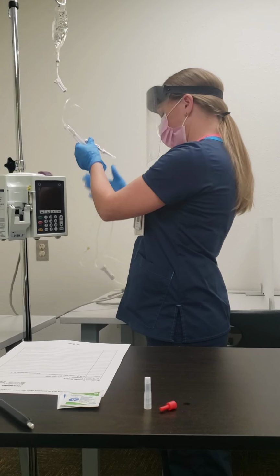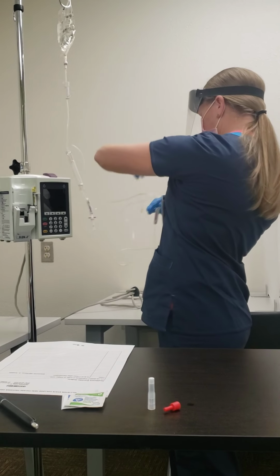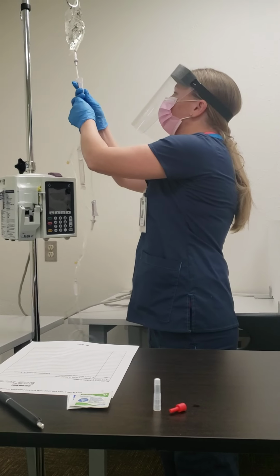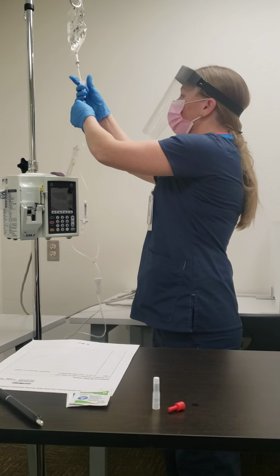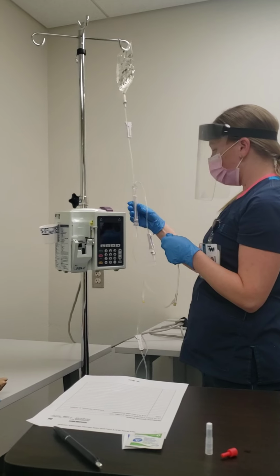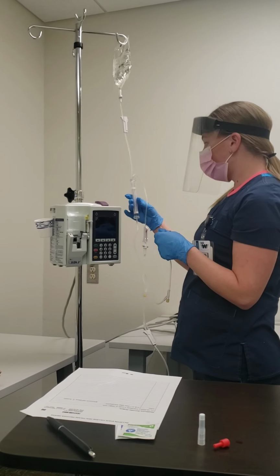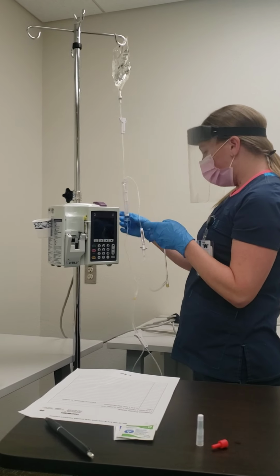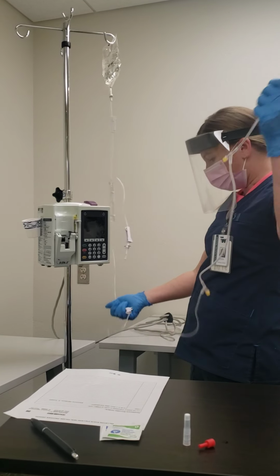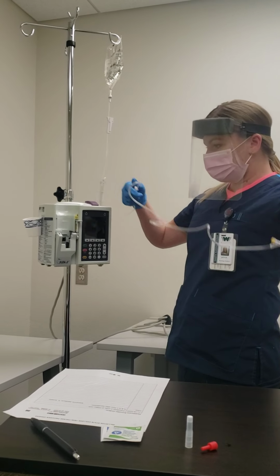So just making sure that all of these are closed once again. Okay, and I'm just going to go ahead and open this one and fill my drip chamber about halfway. Okay, that looks good. So we'll go ahead and prime and get all of the bubbles out of the line.